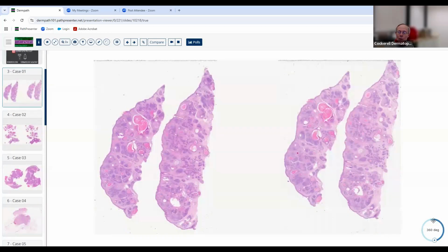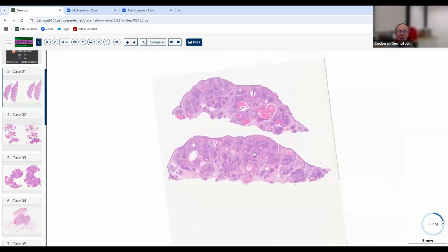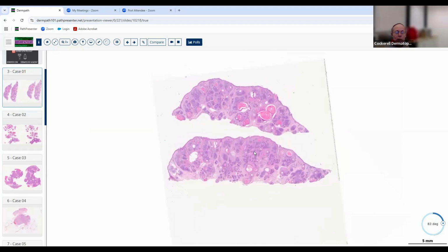Okay, so we have a shave biopsy. When I'm reading cases, I'm usually making what seems to people looking like an instantaneous diagnosis. But what I'm really doing is going through the same criteria that I'm saying here, only in slow motion. I've been doing this for so long, I can look at this immediately and say what the diagnosis is, but you haven't. So you need to slow down, start from scratch, go through the steps in a very systematic way, and then arrive at a diagnosis.